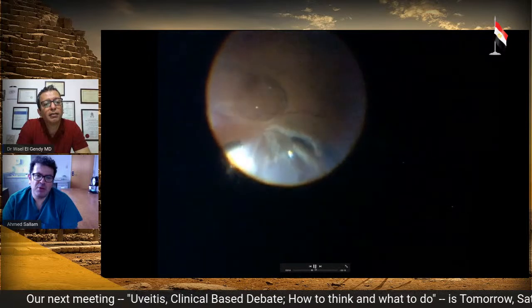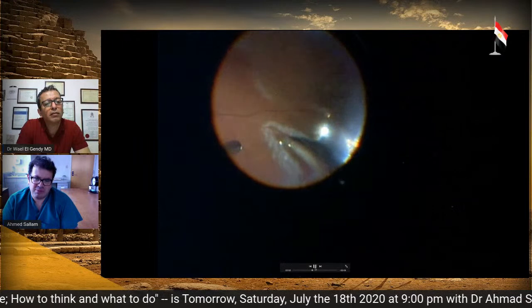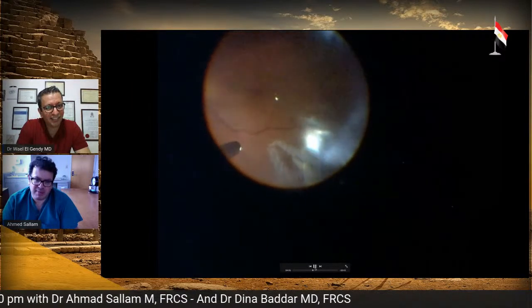Very nice. Ideally, you want to get this bubble over the nerve and remove it over the nerve, but the problem is the retina usually doesn't do what you want. And usually it's not over the nerve. So you can take it over the retina, but just be wary.